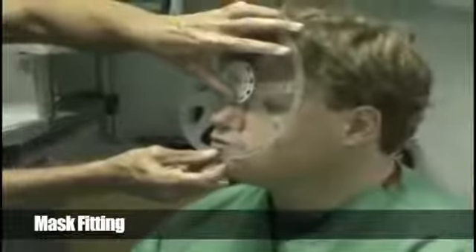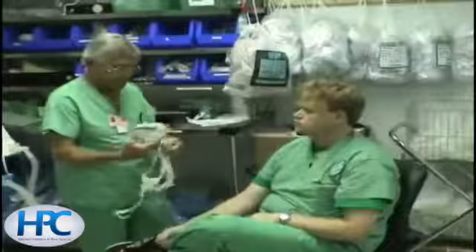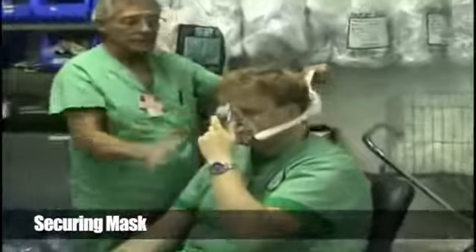This is a fitting wheel that is used to determine the optimal face mask size for the patient. It fits over the bridge of the nose and you want to cover the entire mouth. Here the mask is being connected to the patient with a head strap.